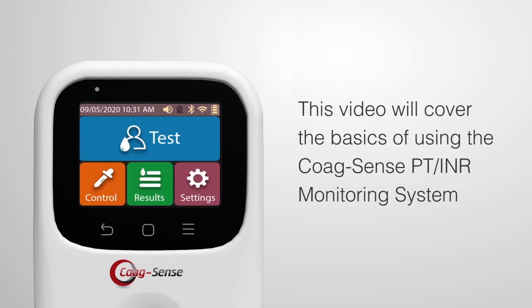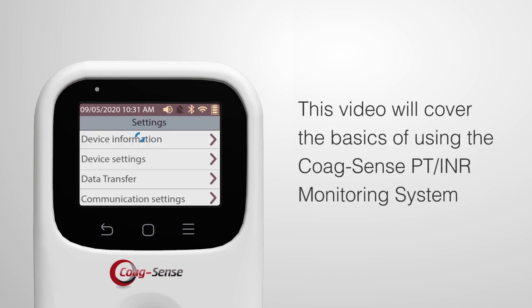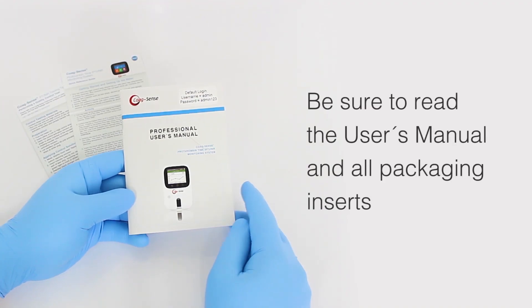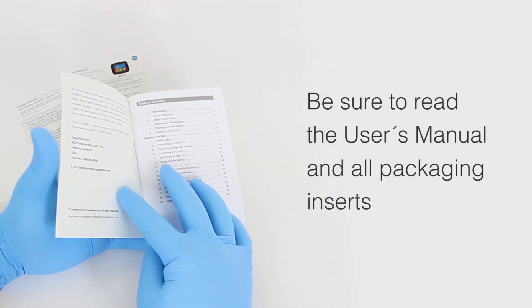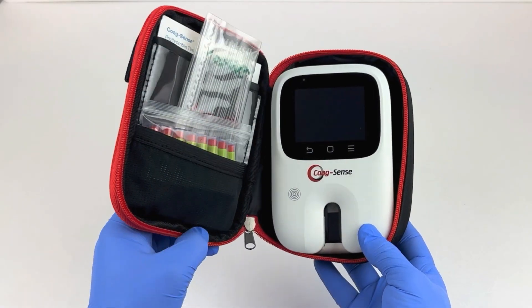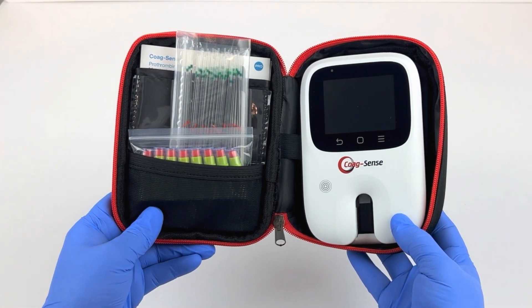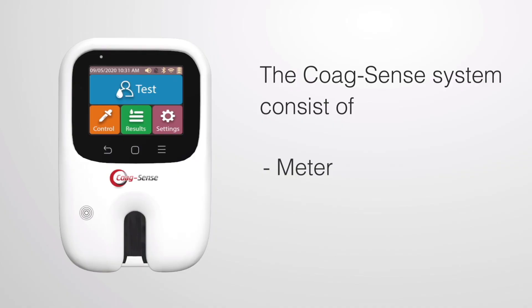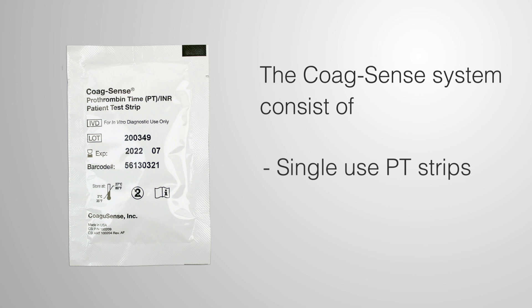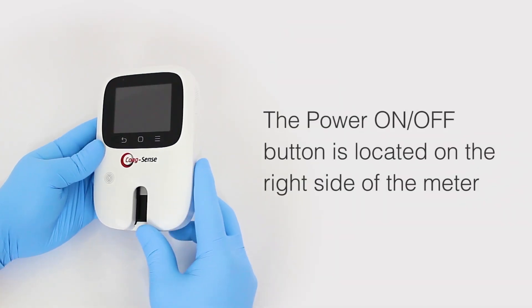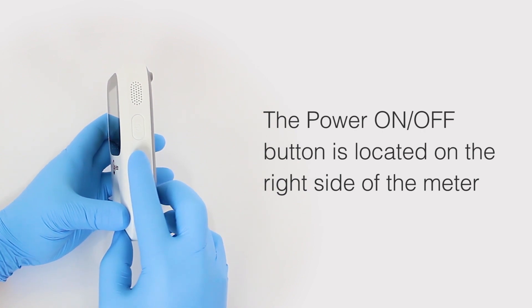This video will cover the basics of using the CoagSense PT-INR Monitoring System. For complete instructions, please be sure to read the user manual and all packaging inserts. Everything you need is provided in the kit, delivered in a carrying case, which includes the meter, lancets, single-use PT strips, control strips, sample transfer tubes, and certain accessories required for testing.